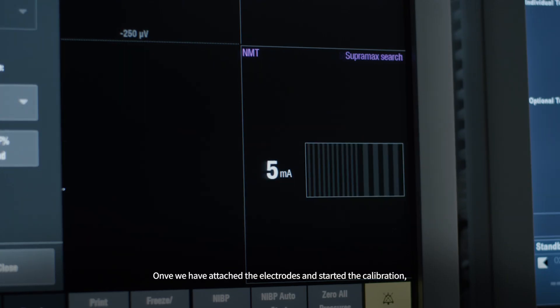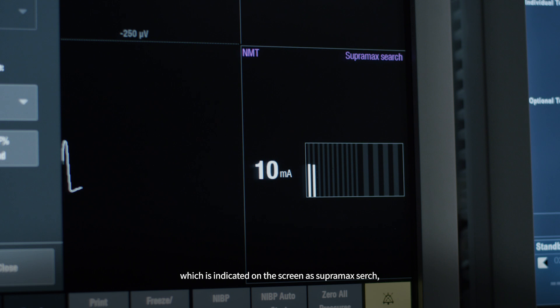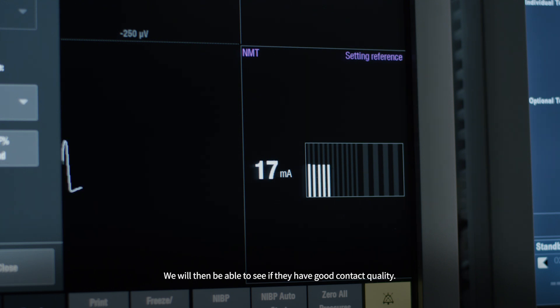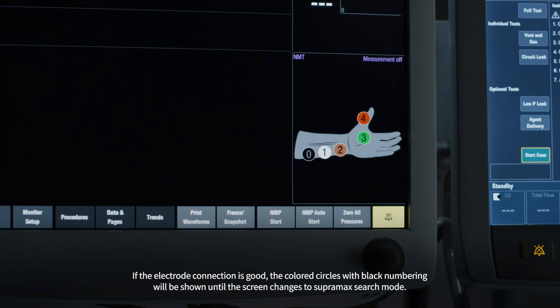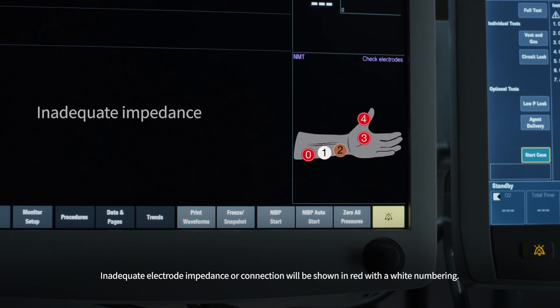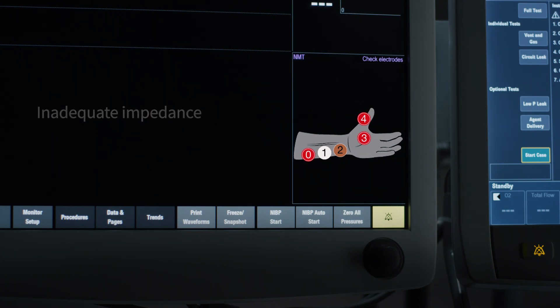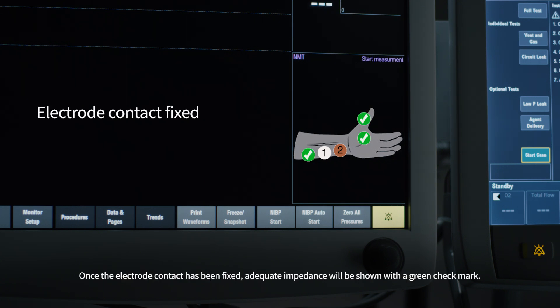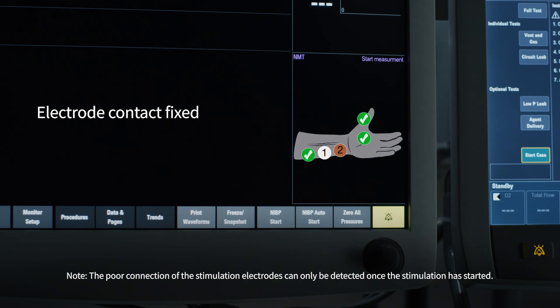Once we have attached the electrodes and started the calibration — indicated on the screen as SupraMax Search — we will be able to see if they have good contact quality. If the electrode connection is good, the colored circles with black numbering will be shown until the screen changes to SupraMax Search mode. Inadequate electrode impedance or connection will be shown in red with white numbering. Once the electrode contact has been fixed, adequate impedance will be shown with a green checkmark. Note: poor connection of the stimulation electrodes can only be detected once stimulation has started.